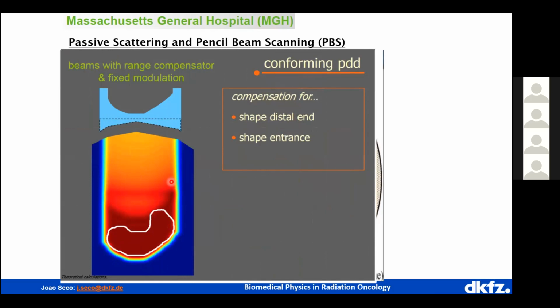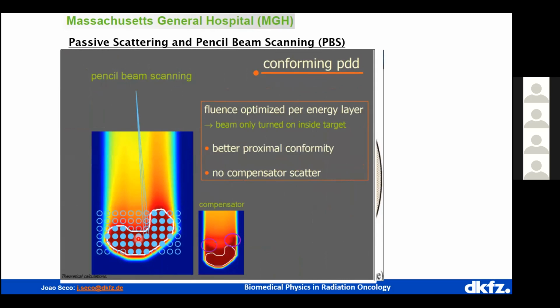I have the horns. In pencil beam scanning, I have basically like a television. I can basically spot any region and produce any shape of dose distribution I want. And so the horns have disappeared. I've completely lost them, and I shape any type of organ tumor that I need. So the big difference is the hot areas that I had in the passive scattering are now gone, and I have a perfectly shaped tumor.